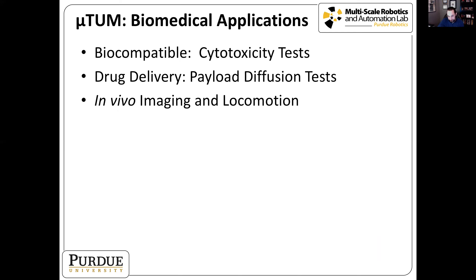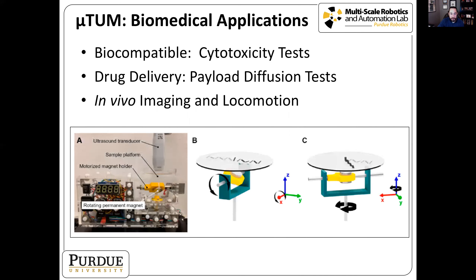Next, we wanted to perform in vivo imaging and locomotion tests. To control the robot inside an animal model we developed a new test apparatus using a rotating permanent magnet with an ultrasound transducer probe underneath for in vivo imaging. We can rotate the magnet to get the robot to rotate at different frequencies inside the workspace, and a second actuator rotates the whole magnet for steering — giving us two degrees of freedom of control along with real-time ultrasound imaging.